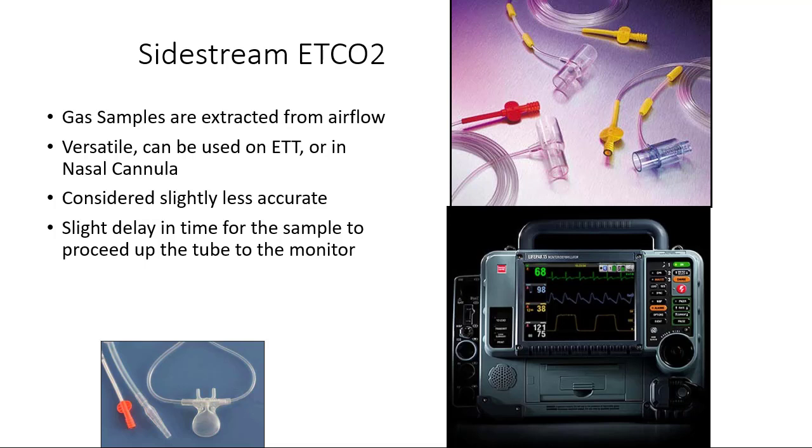They also have variations of this that are used with nasal cannulas, as you can see right down here in the bottom. Now, the key thing that most people don't realize is that the nasal cannula has to be positioned correctly. If you just throw it on and it's half hanging in the nose and this little bit isn't hanging over the mouth, it's not going to be accurate. It has to hang out over the mouth, and hopefully you don't have a beard full of chunky peanut butter getting in the way.